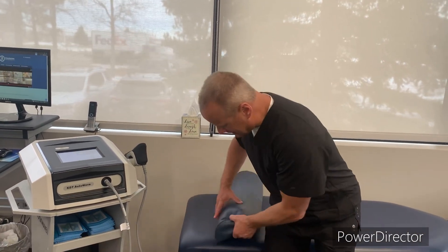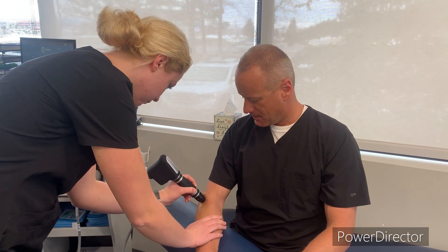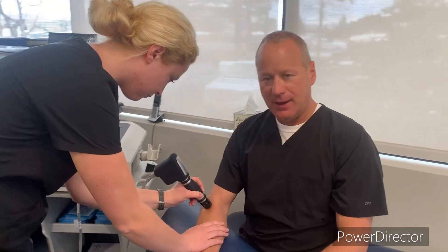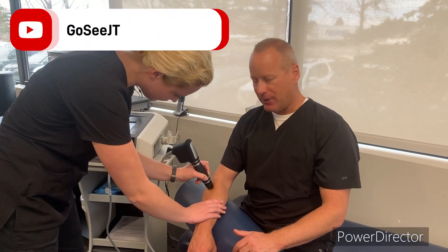So I'm just going to sit right here. This is ultrasonic gel that doesn't absorb into the skin, and she'll provide the shockwave therapy. It's going to be a rapid-firing acoustic device that's going to break up all that scar tissue in the elbow. I can alert her on my intensity and what I'm feeling, and she can either raise or lower the amount of bars.